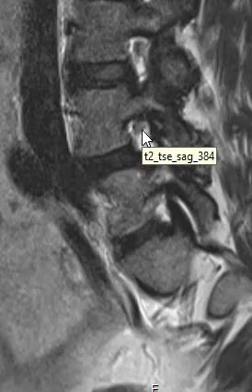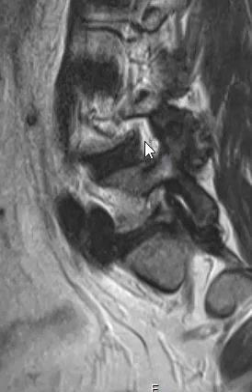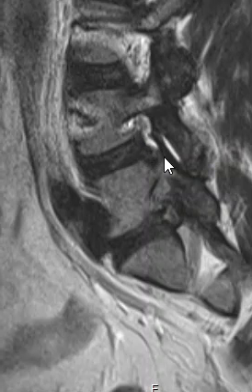Now you can see a nerve coming out here just fine. This is the right L4 nerve - looks good. We go off to the other side - oh no! That's the nerve there on the left getting pinched and elevated by this end plate spurring, and also this overgrown facet.